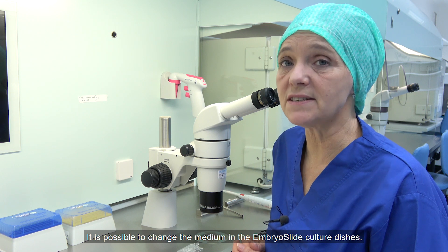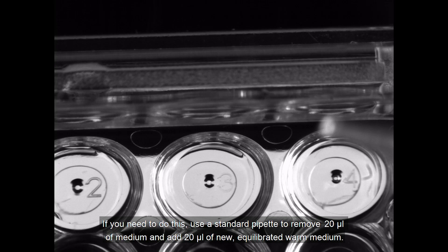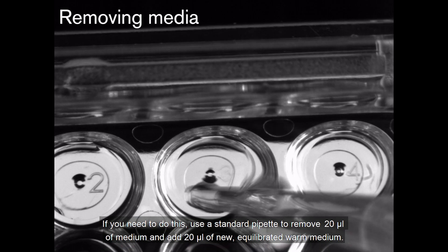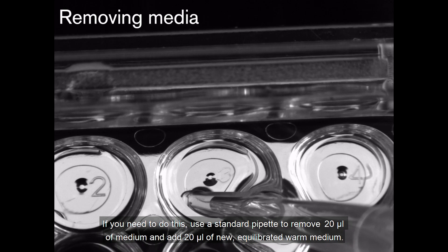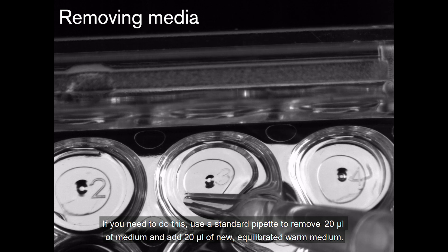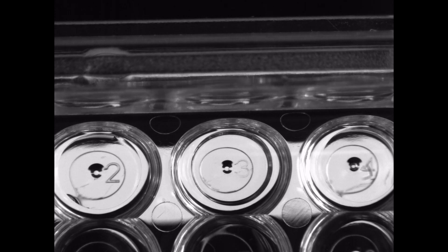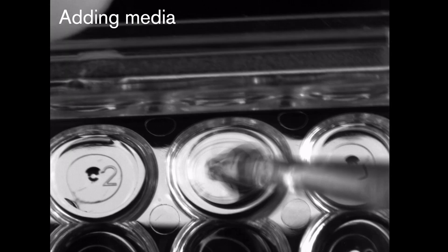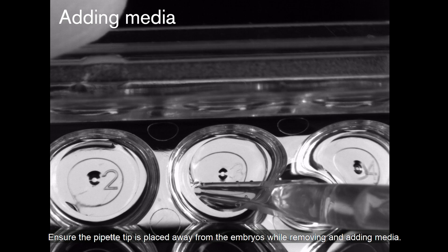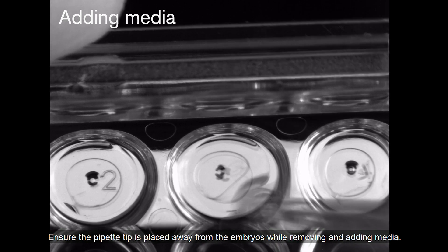It is possible to change the media in the embryo slide culture dishes. If you need to do this, use a standard pipet to remove 20 microliters of medium and add 20 microliters of new equilibrated warm media. Ensure the pipet tip is placed away from the embryos while removing and adding media.